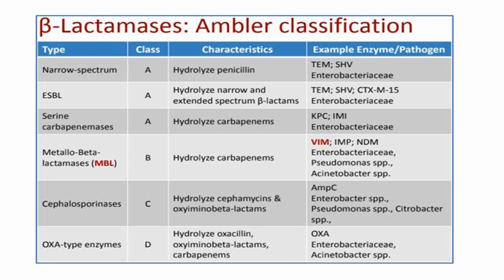What do I understand by ESBL? ESBL means resistance to cephalosporins till third generation. KPC means resistance to carbapenems. And MBL means resistance to carbapenems. OXA means resistance to oxacillin and carbapenems. So AmpC cephalosporinases means there is a hydrolysis of cefamycin, that is cefoxitin, or it is an AmpC producer.